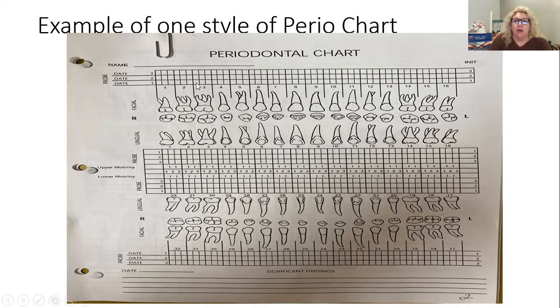So if I've done a couple numbers here and they let the patient swallow, the next number I might need would be number 4, the distal. So I would say distal buccal 4. And I would tell my doctor or my hygienist distal buccal 4, and then they would give me that number and we would continue charting. Every so often, I'm going to stop and I'm going to say, where am I? And I need you guys to look at the next empty slot that you need the number for. What is that position? What area am I in?